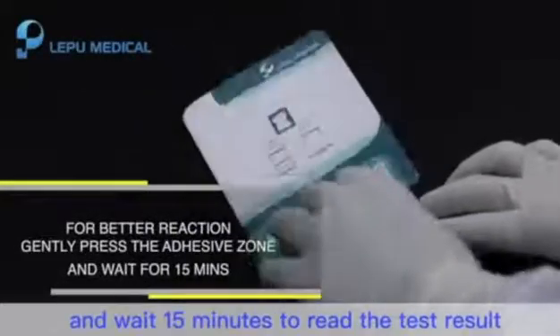Step 6: Fold the left side over and wait 15 minutes to read the test result.